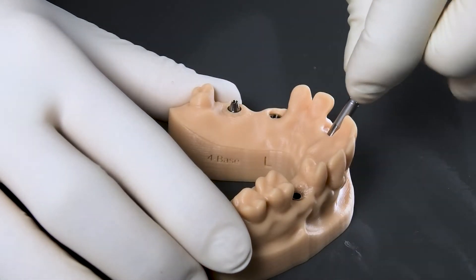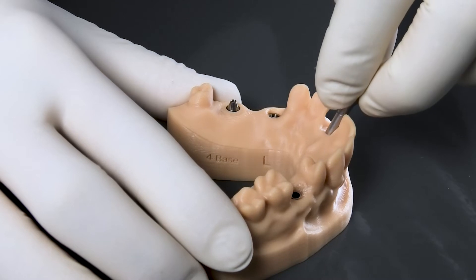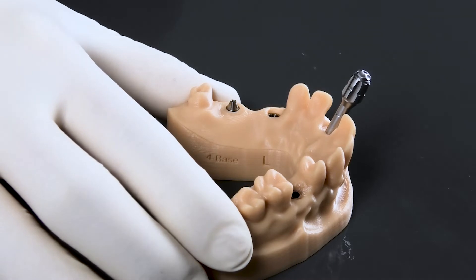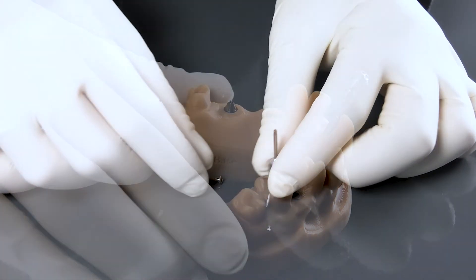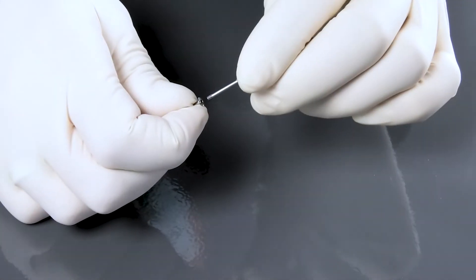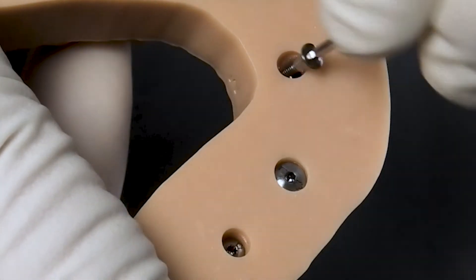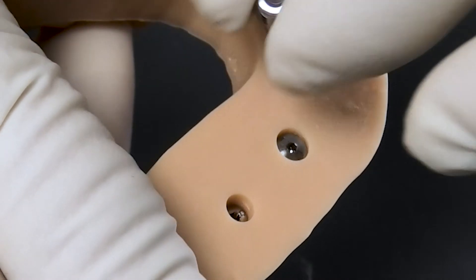The laboratory implant is picked up with the insertion key and placed into the cavity of the printed model. The intuitive mechanism gives audible and tactile feedback as soon as the laboratory implant is seated correctly and the final depth has been reached.